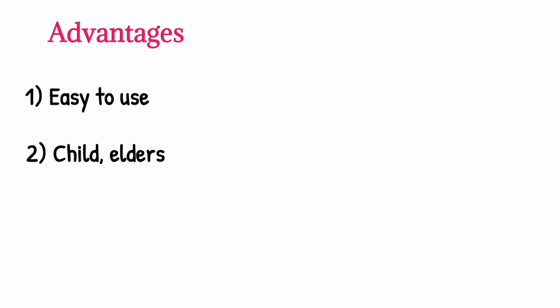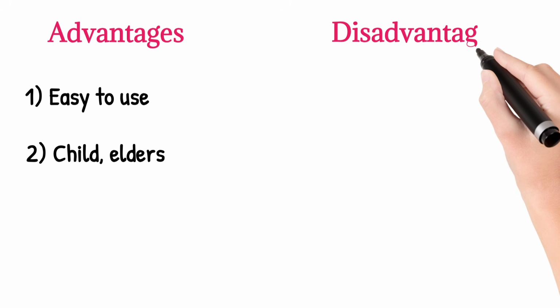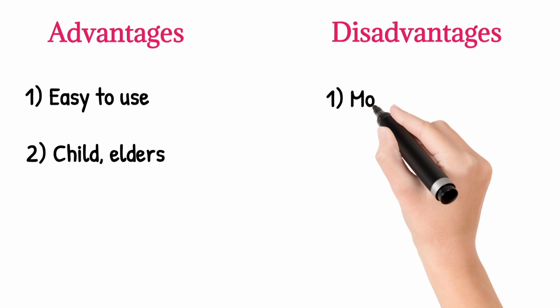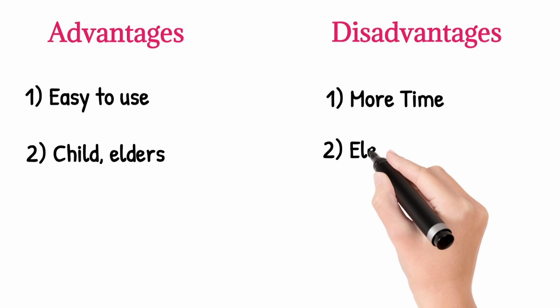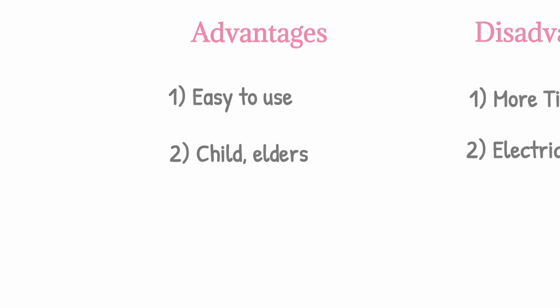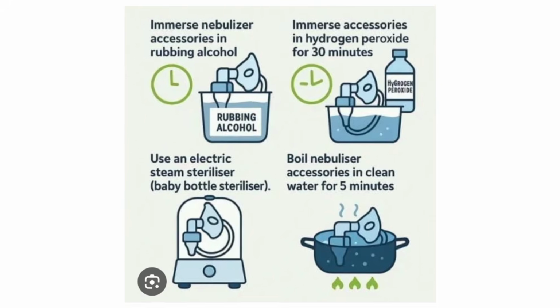But the main disadvantage is that, compared to the inhaler, a nebulizer takes a longer time to complete the medicine, and it requires electricity and proper cleaning. Cleaning is very, very important in a nebulizer.